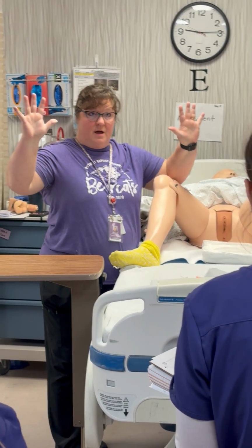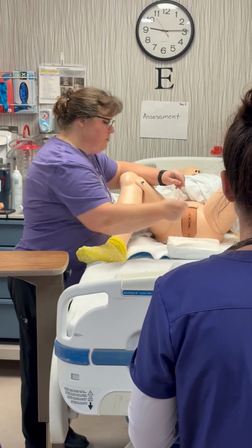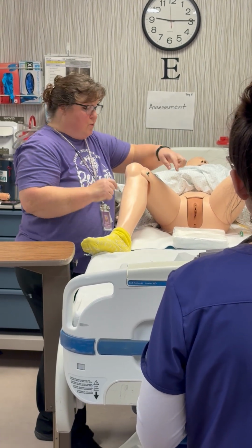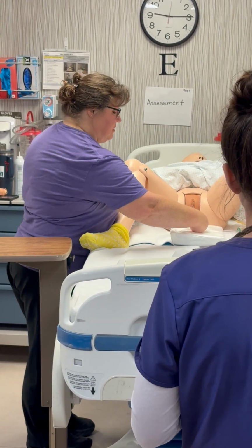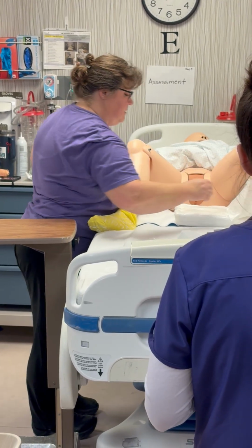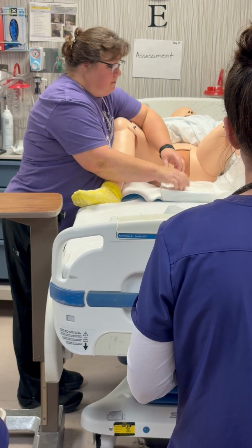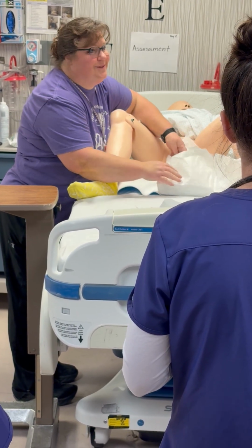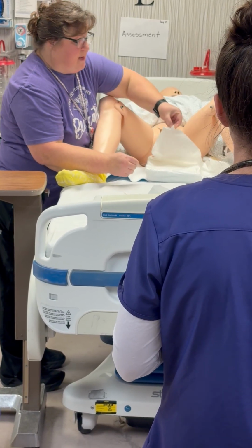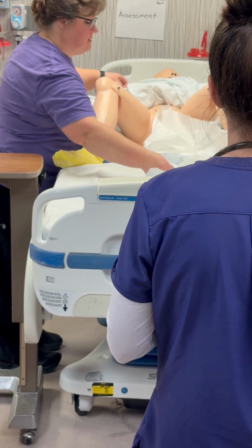Do I have sterile on? No. Okay, so I am only going to grasp, try to keep only that inch border, right? So when I grasp this, I want to make sure I'm keeping that inch border, okay? And then open these sides. A lot of times I see you guys doing this. Okay, don't do that, okay? You need to actually be watching what you're doing, grasping that inch border, okay, on both sides.